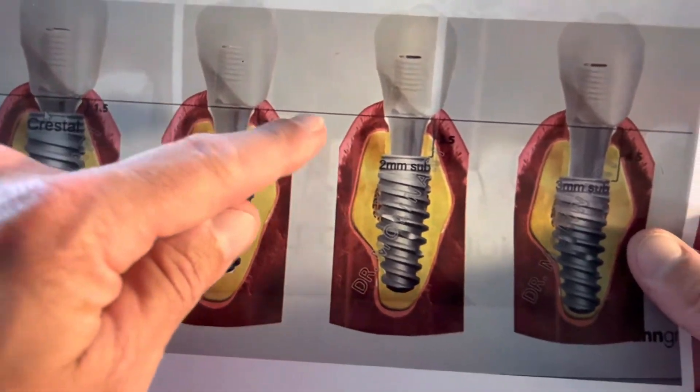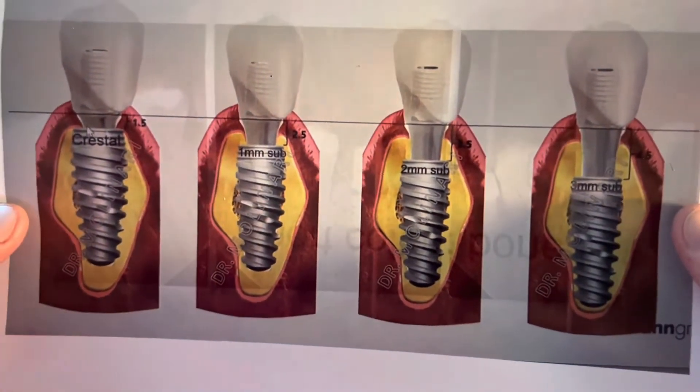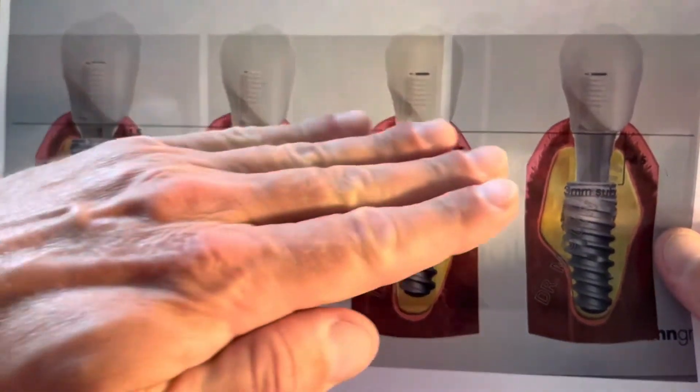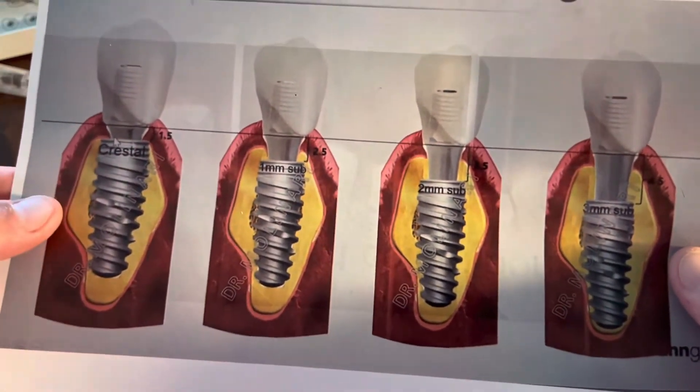We notice that we've got three completely different margins or heights on the abutment, but everything from that margin line up looks exactly the same for the restoration. Very important.